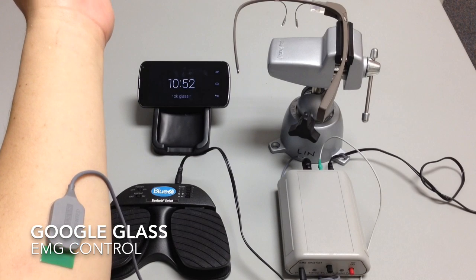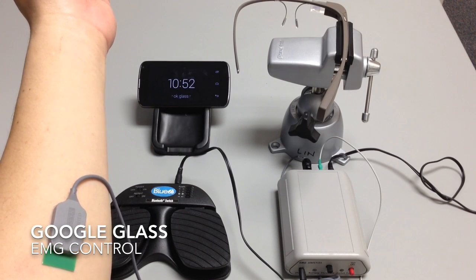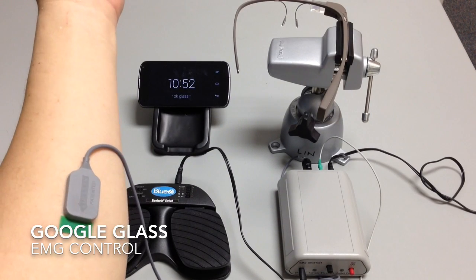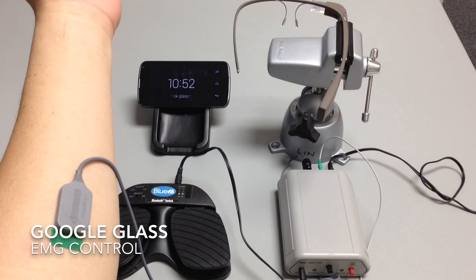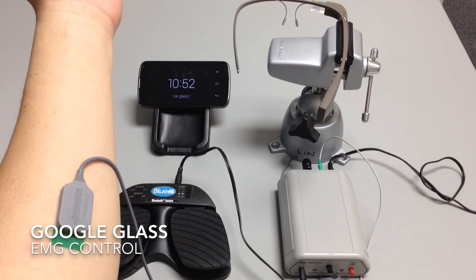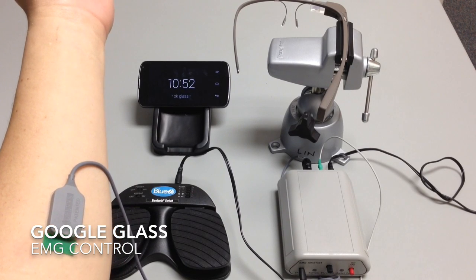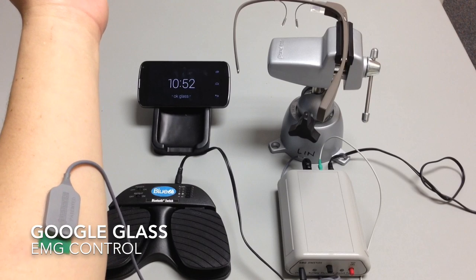So when I turn the switch on, the muscle activation here is going to activate the right timeline. It's going to advance the timeline to the right.